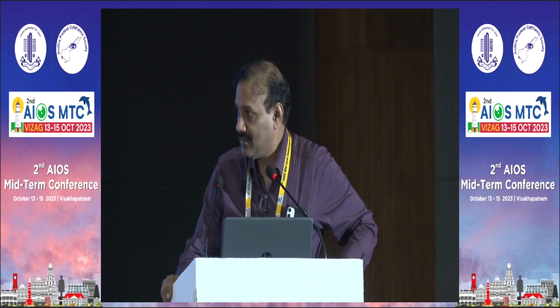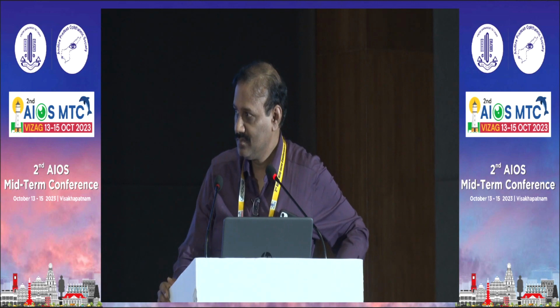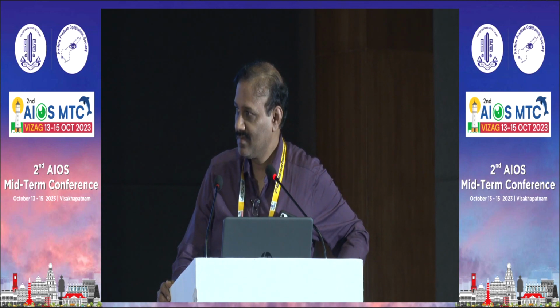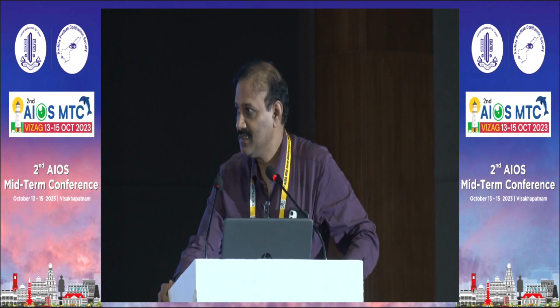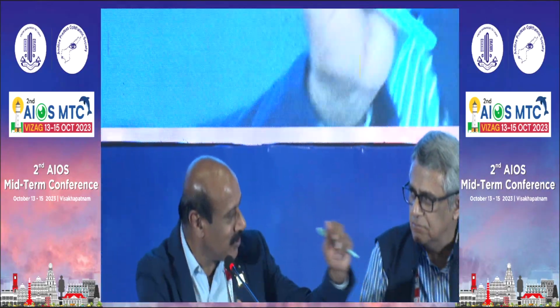Ultimately the management approach depends on 2-3 factors combined: what is the fundus picture, what is the visual acuity, what is the OCT, whether there is traction or not. Based on these, we choose a treatment. When a classic picture is there, the algorithm will be followed. When the mixture is there, experience will guide.